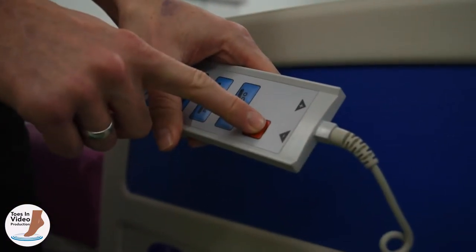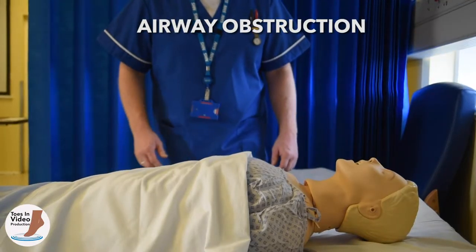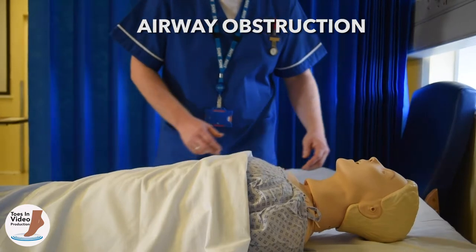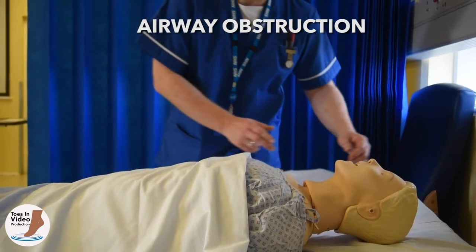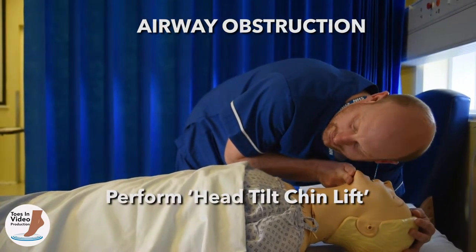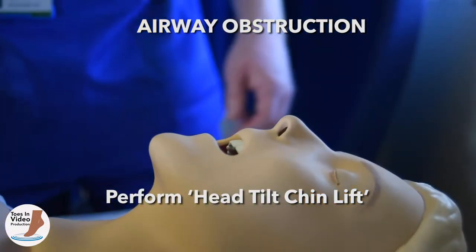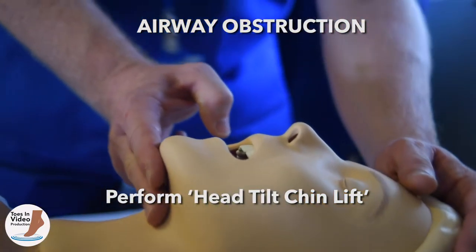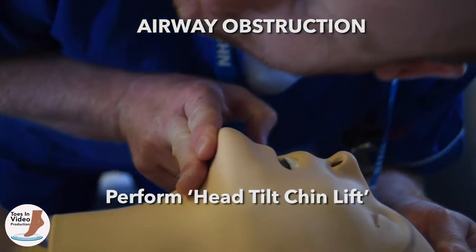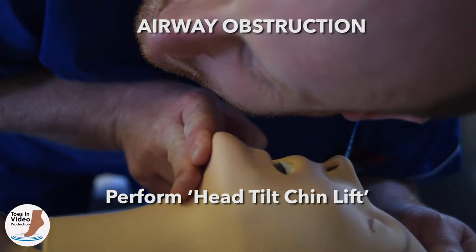The unconscious patient lying on their back is likely to have a partial or complete airway obstruction due to loss of muscle tone in the pharynx, causing the tongue to fall backwards. Open the airway using the head tilt chin lift manoeuvre. Position yourself at 90 degrees to the patient's side and place one hand on the patient's forehead and two fingers under the chin. Tilt the head so the patient's chin is elevated and supported by the two fingers, and the head is stabilised by the palm on the forehead.